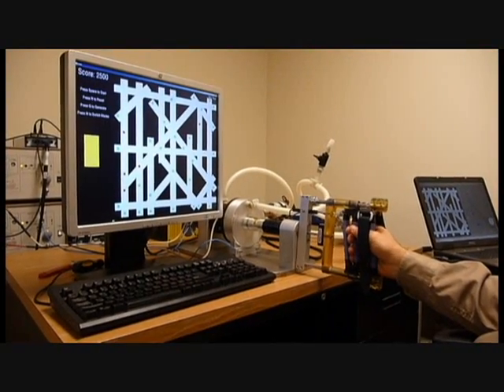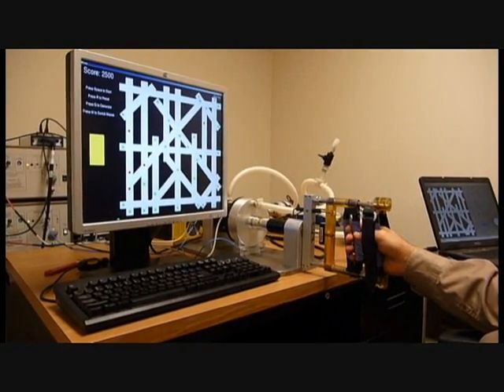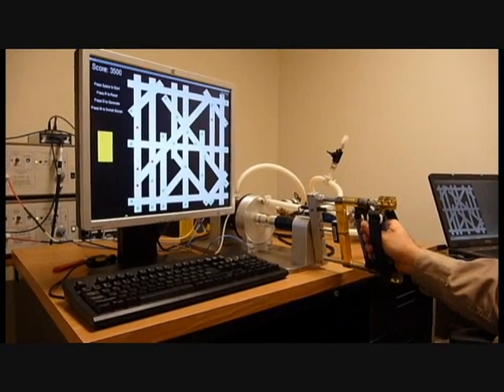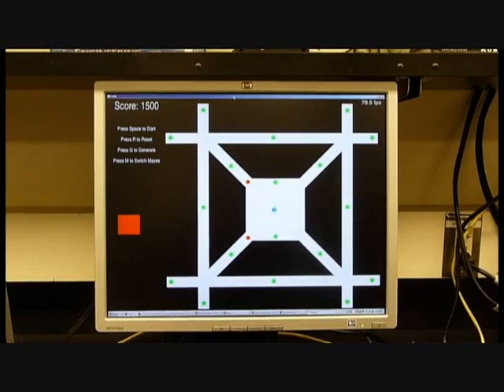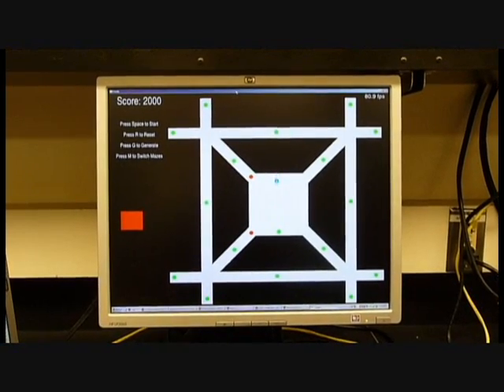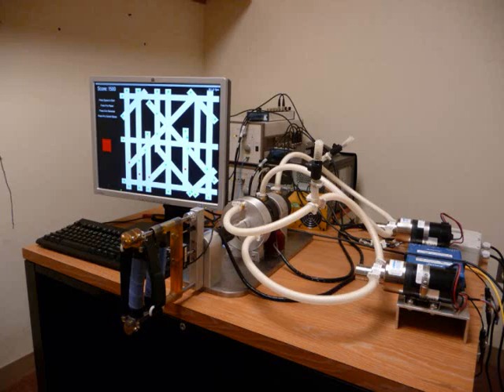The system also connects to a graphical user interface consisting of mazes for the patient to navigate while exercising, creating an interesting rehab environment where wrist pronation supination moves the dot left and right, and finger flexion extension moves the dot up and down. The first generation of the system is highly effective.